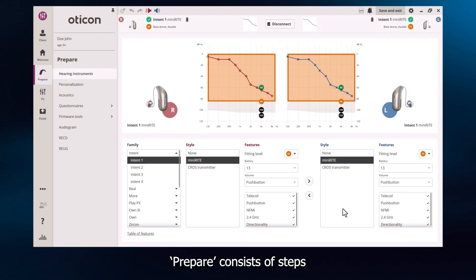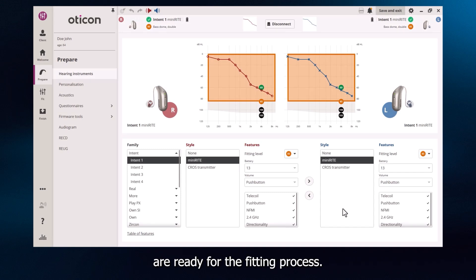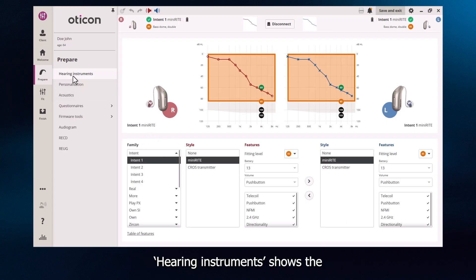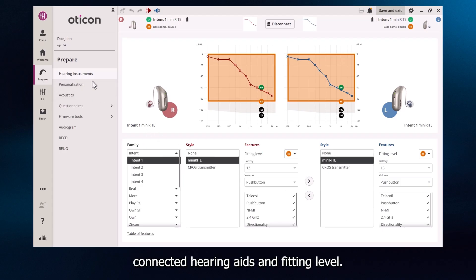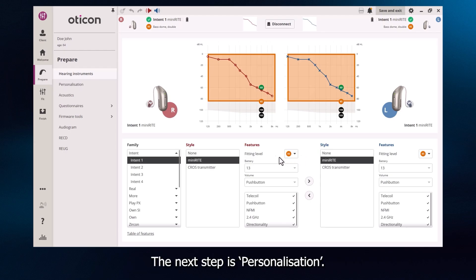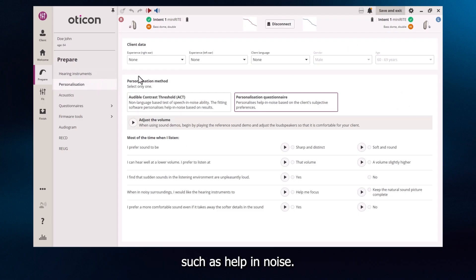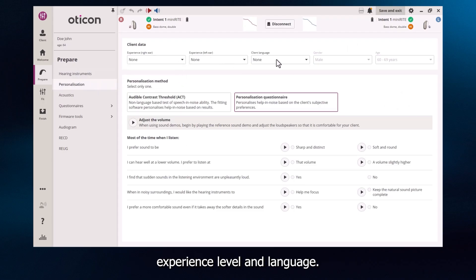Prepare consists of steps to ensure that the hearing aids are ready for the fitting process. I'll highlight three of these steps here. Hearing Instruments shows the connected hearing aids and fitting level. The next step is personalisation. Completing this step prescribes tailored settings for your client, such as help in noise. Start by selecting your client's experience level and language.